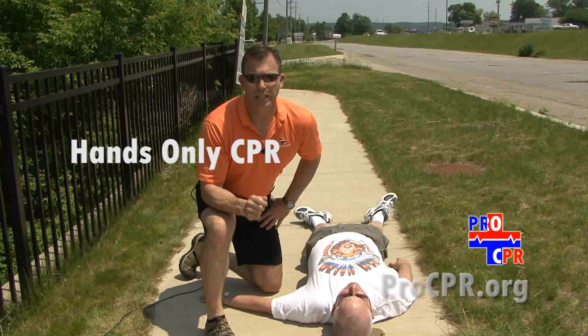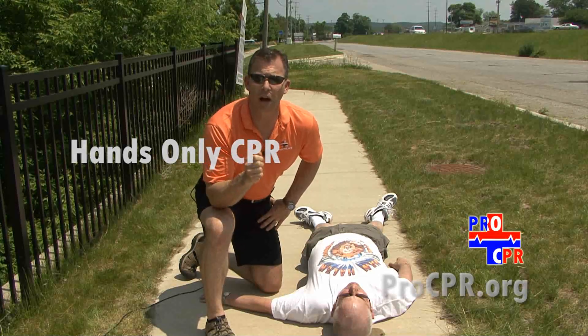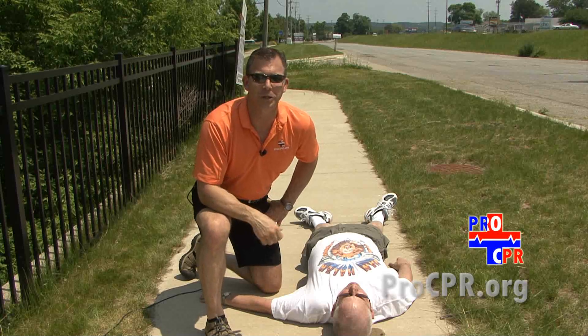Hands-only CPR is really easy to learn, but it would be wise for us to go through the steps one time before we take a quick quiz.